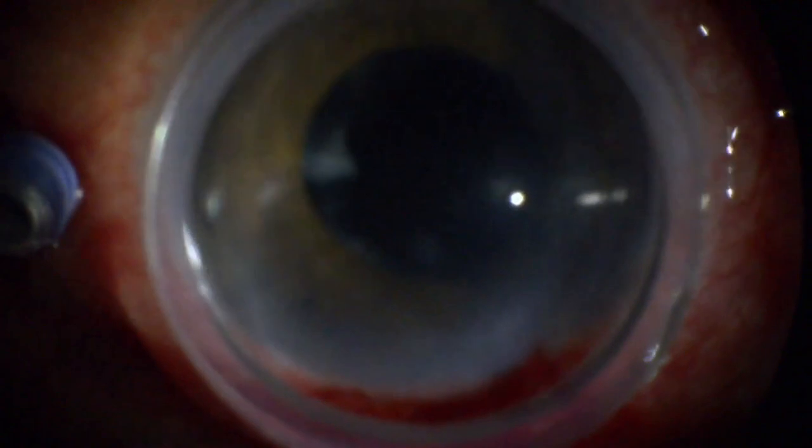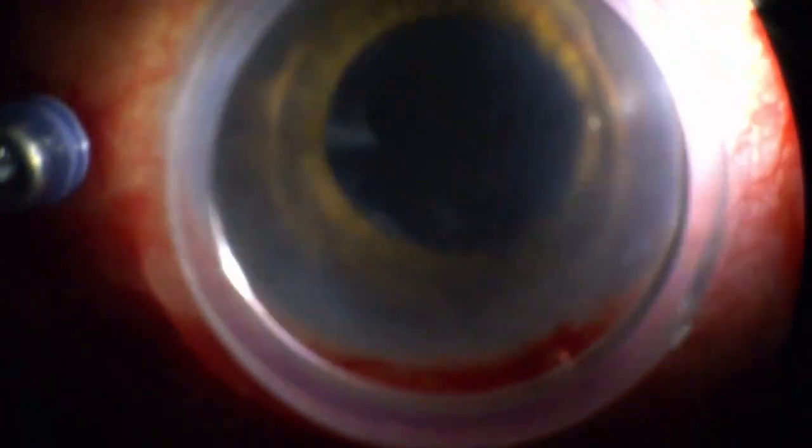I'm going to take the vitrector. So this is a little awkward, the grab going this direction. So let me show you something you can do with the vitrector. We'll take the left hand. And peeling with the vitrector, one advantage in the left hand is that you don't have to actuate a forcep. You just use your foot.